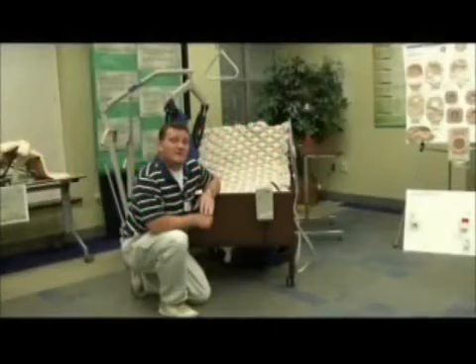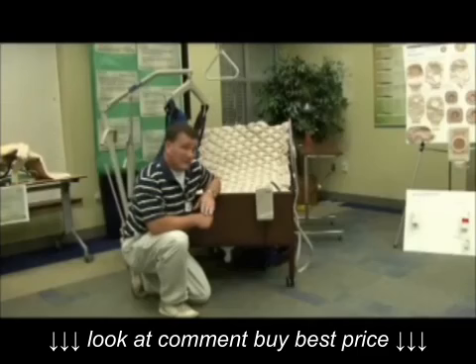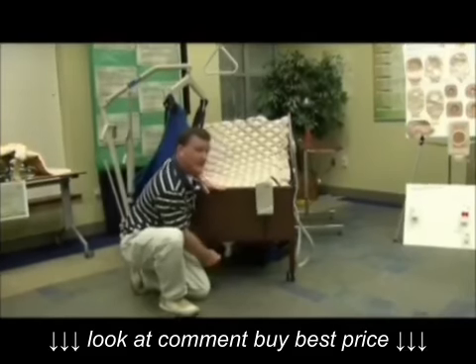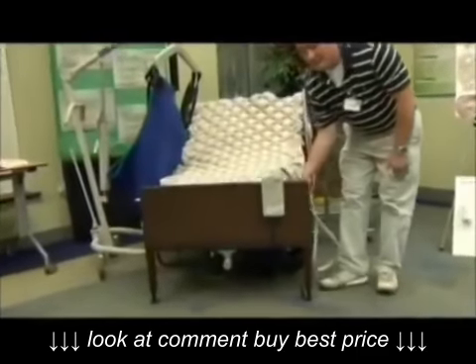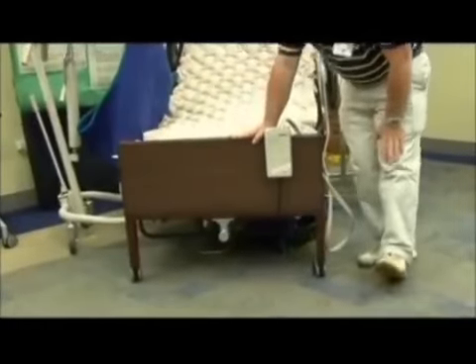The very first thing you'll need to do is unplug your electrical bed from the outlet or power source. Then you'll need to locate your emergency crank. It could be located either at the footboard, underneath your mattress, or on the floor underneath your electrical bed.